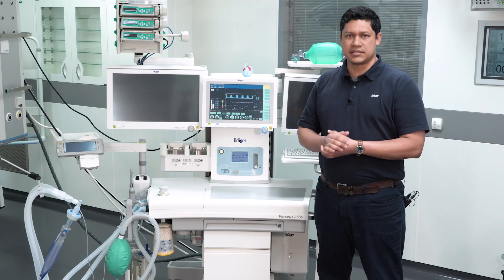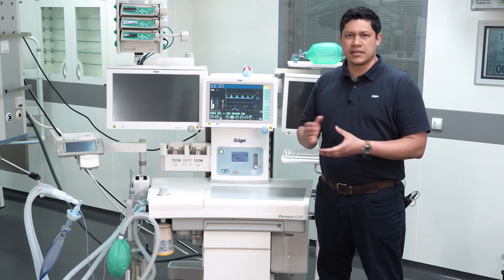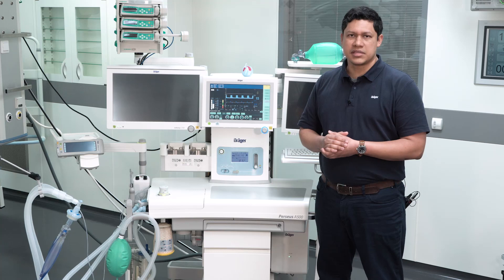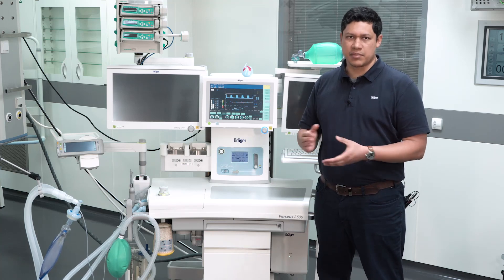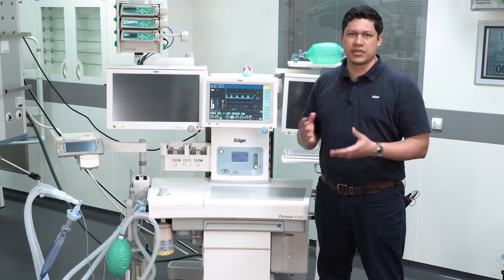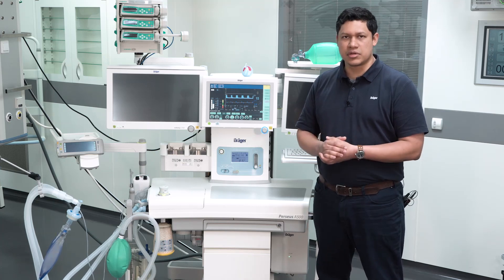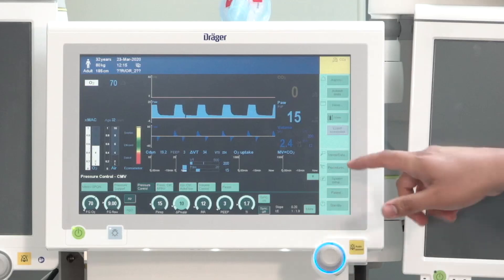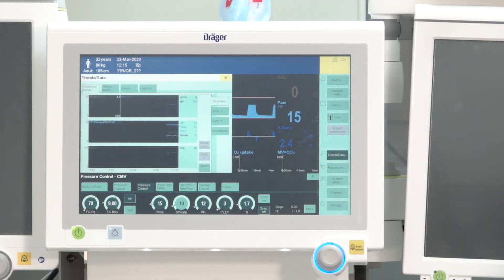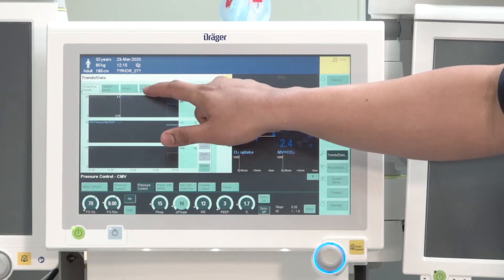Be aware that the anesthesia device will automatically delete the alarm messages on the display once the event triggering the alarm has disappeared. To verify alarms that might have occurred in the absence of the user, first go to the trends and data button, and then go to the logbook tab.